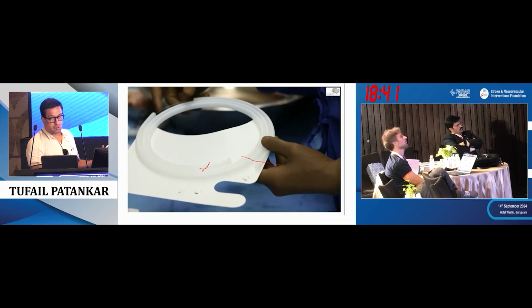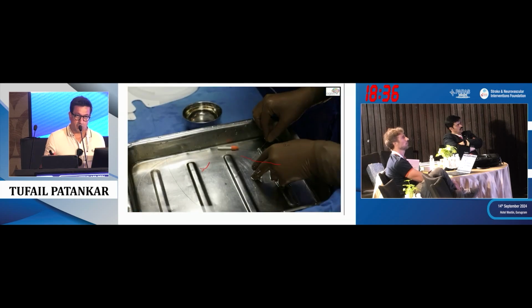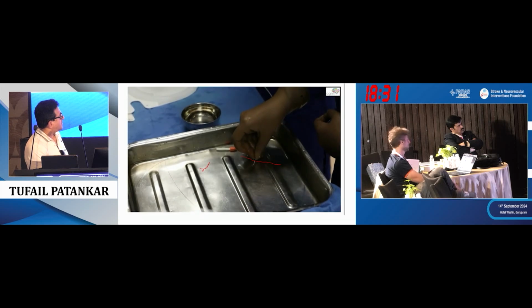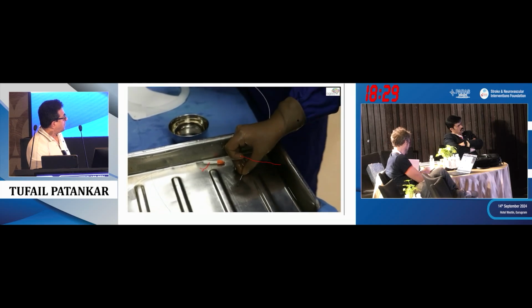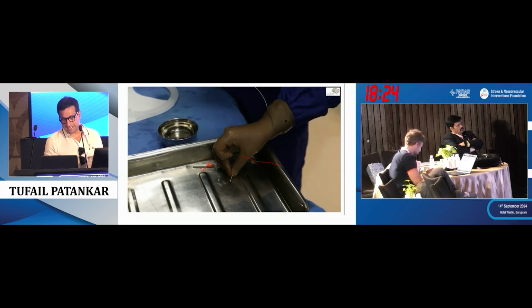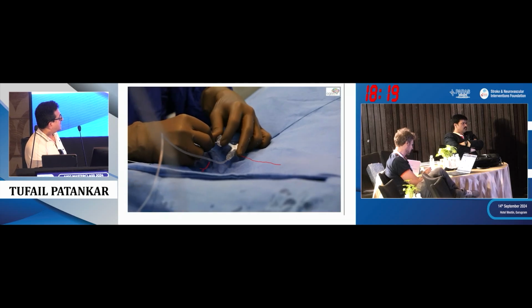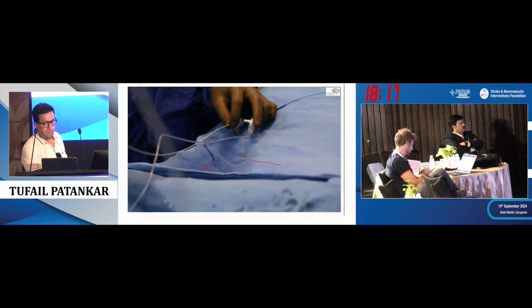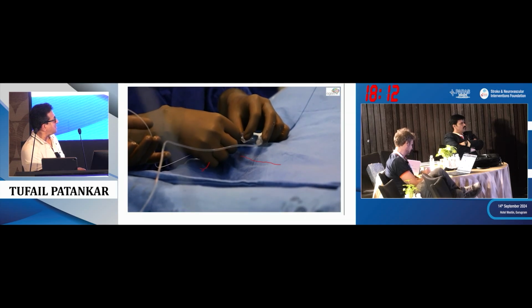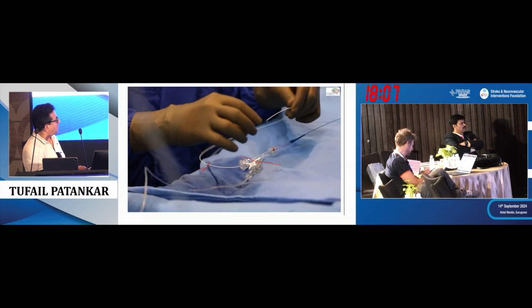I always use two hands, one hand to control, one hand to push the device. Everything in neuro, if you're just starting, learn to control things. Here the device is being prepared. You prepare it in the water, you push it out, make sure, like any flow diverter or braided stent, it's the same thing that you do. The device is being tested, then you put it in the back of the hub, and there you go, you get a flush in the back.